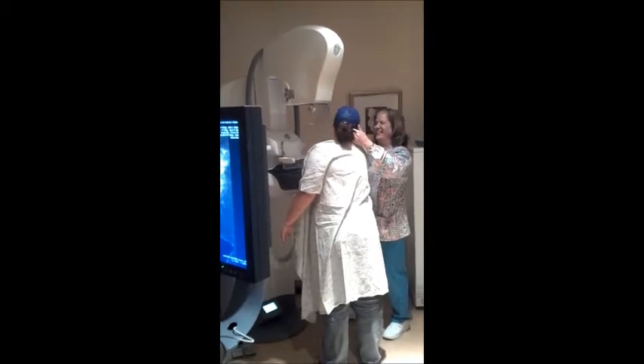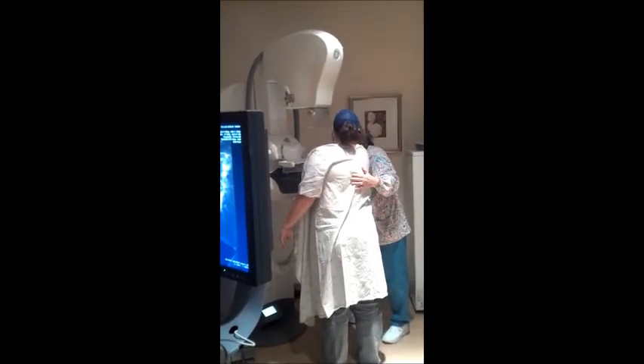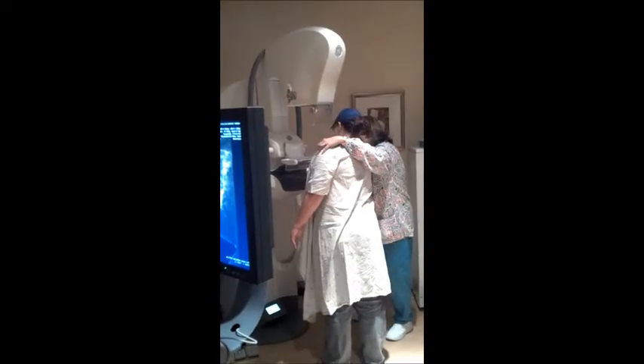I'm not going to let you keep your head like this. You don't want your head to turn your shoulder back. Very good. You are really good with the compression.